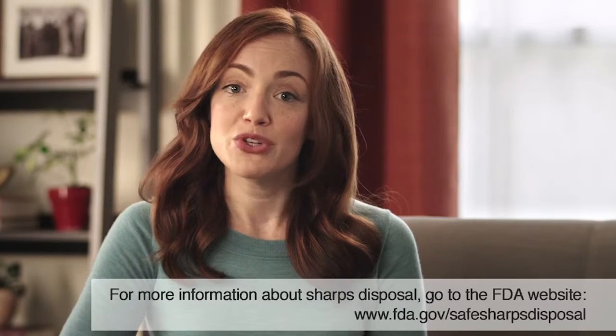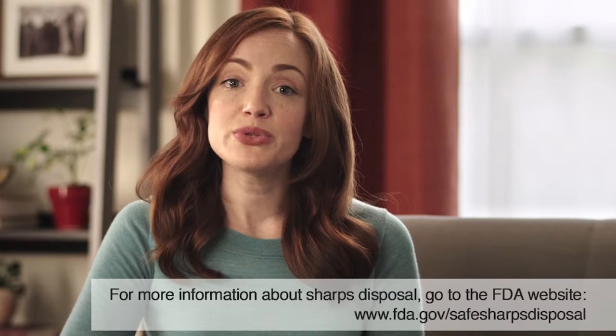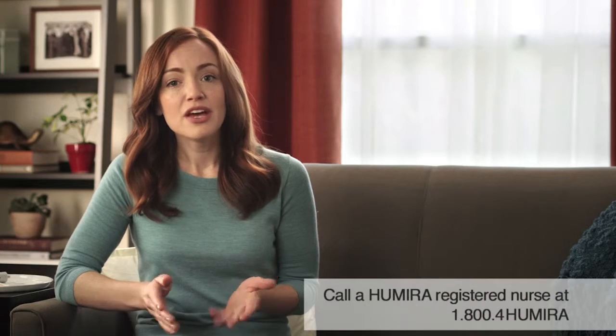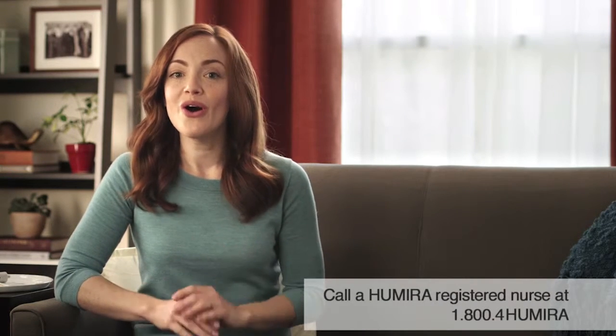For more information about sharps disposal, go to the FDA website www.fda.gov/safesharpsdisposal. Okay, that's it. If you have questions at any time, just pick up the phone and talk to a Humira registered nurse or call your doctor. I find it helpful to use my phone to keep track of my injections. I also make notes in my calendar so I can remember when and where I've already injected.